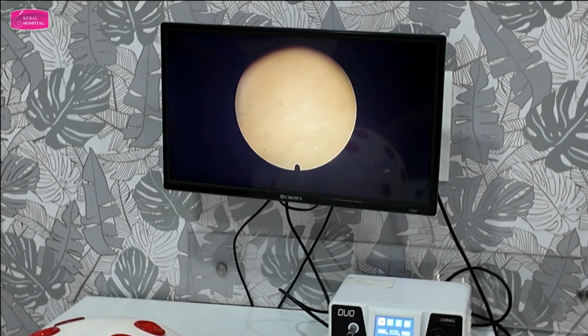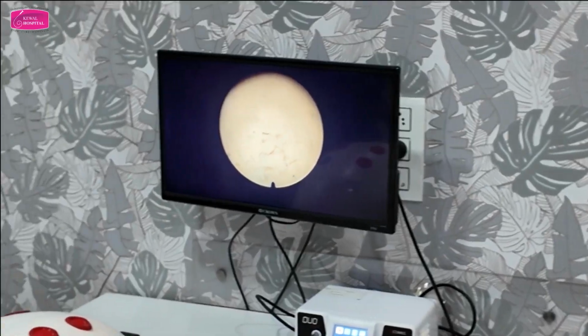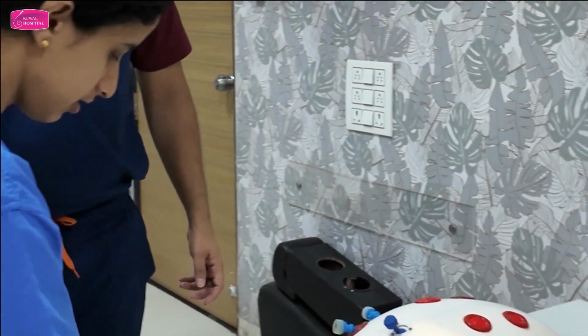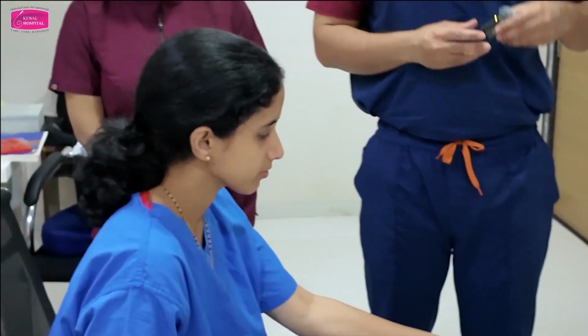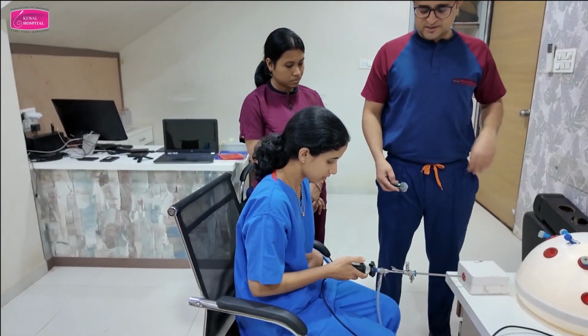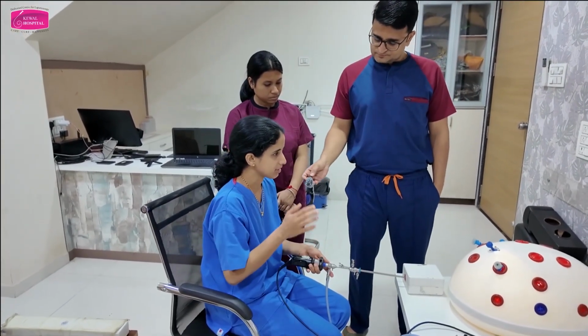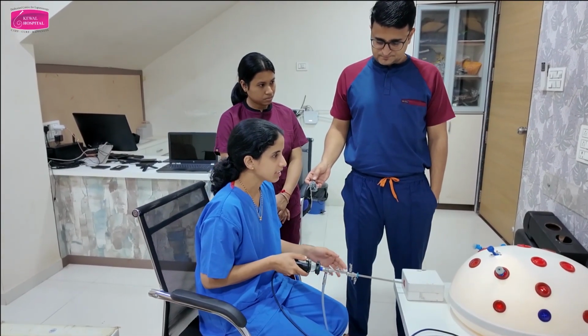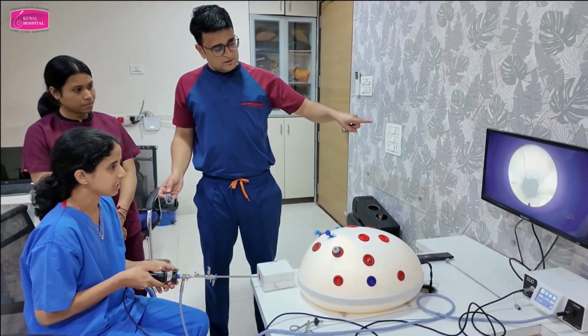Okay? Chalo, come one by one. If you can explain this, it is better for you. Explain everything now. Chalo, you can explain the arrangement here. Always the camera should face up. Correct. And then the notch should be aligned to the endocervical canal while introducing.